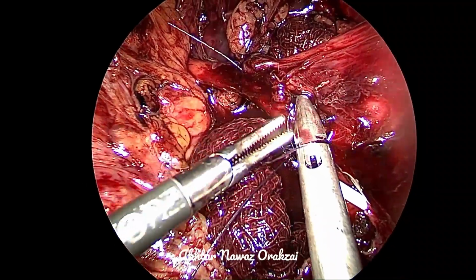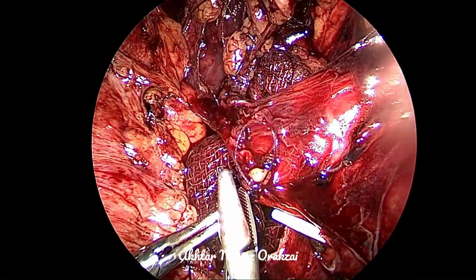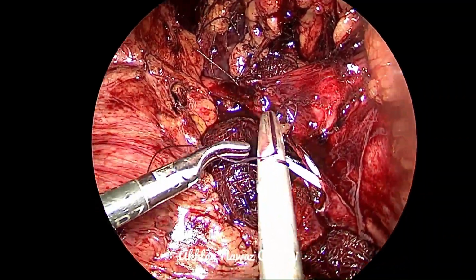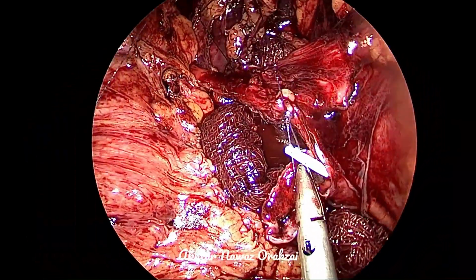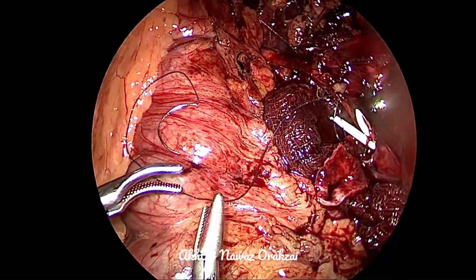Here I take the loop of the previous suture into that suture's loop so that we know that both of them are opposing each other, and then we will knot it. You can knot it, you can even interlock it and then continue with the same suture. It's up to you, so long as the principles are followed.